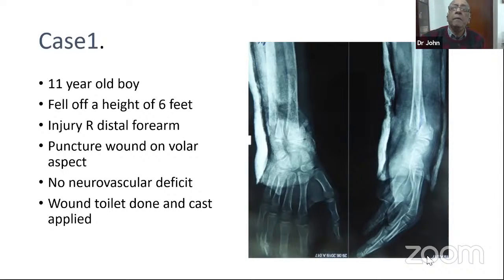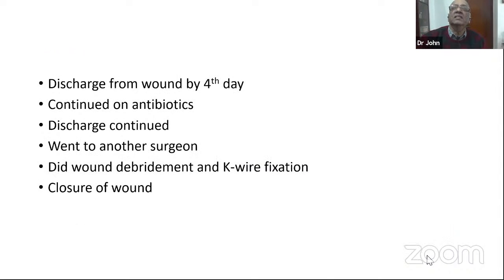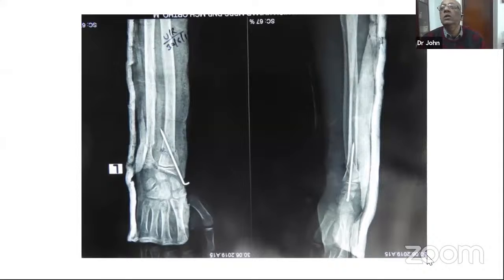Now, by about the fourth day, he had a window through which he was being dressed, and there was a discharge coming from it. That continued for another 3 or 4 days. Then this patient went to another surgeon, who did a debridement and K-wire fixation with closure of the wound. So this is the post-op x-ray at this stage.